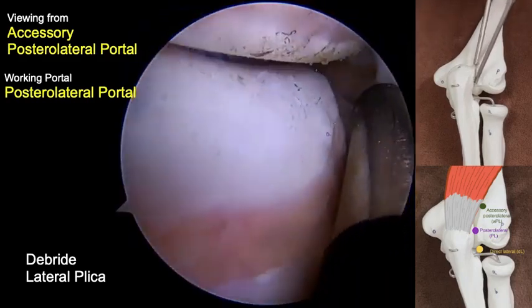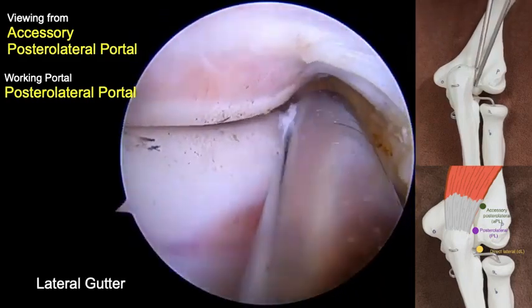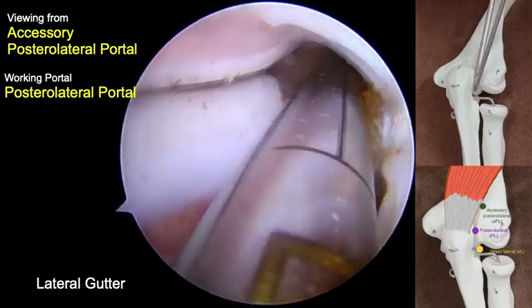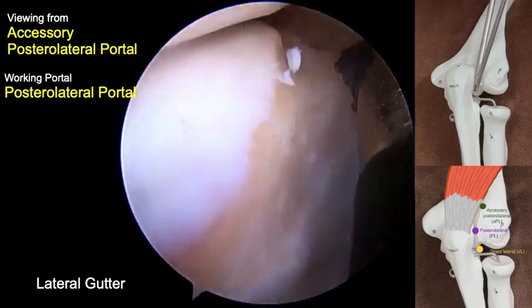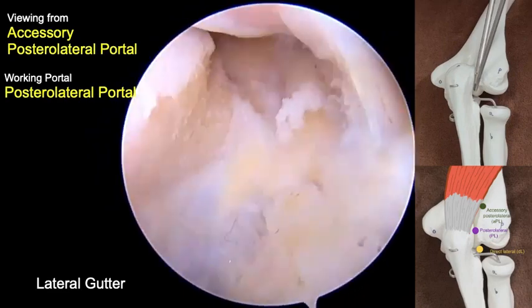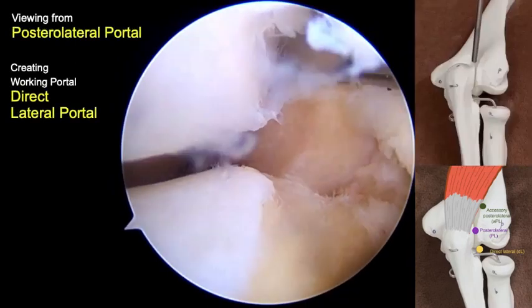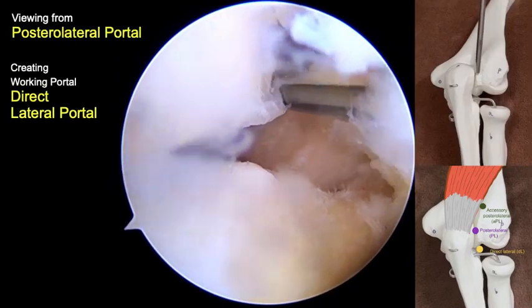This can be solved by arranging the arthroscopic camera tip proximally so that the operating instrument will stay in front of the camera tip. Next, the viewing portal is changed to the posterolateral portal.